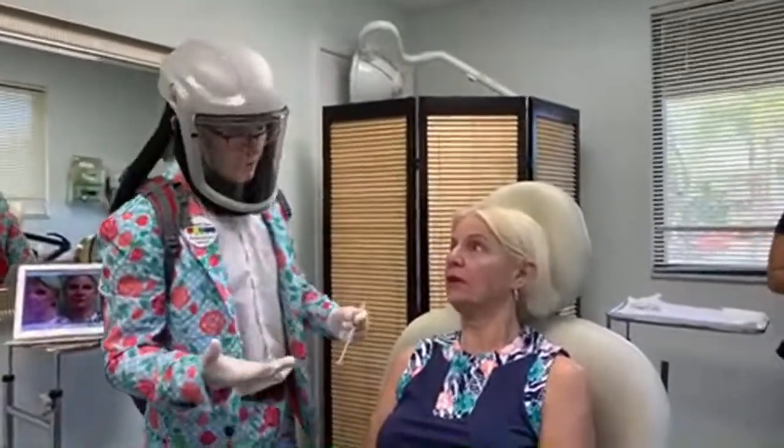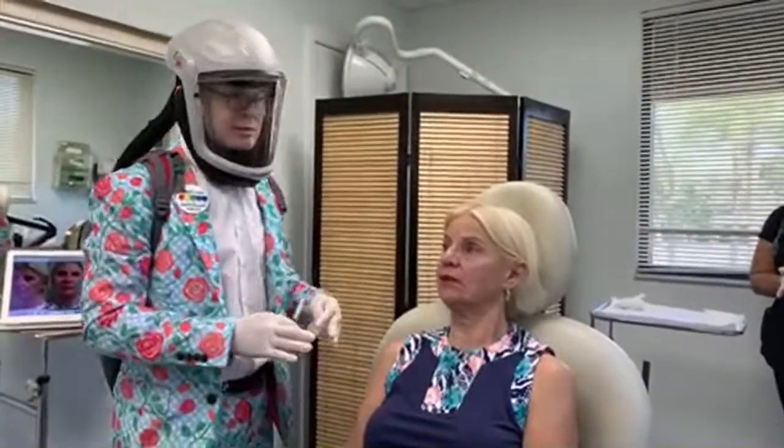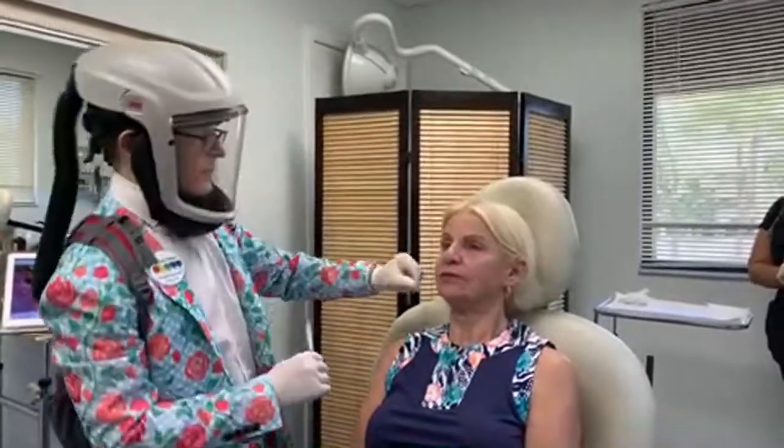This is also a pain test before I do anything else. How are we doing so far? Fine, I'm fine. I think I could tolerate the laser. Well, you had mentioned too, when you had laser before, they didn't numb you and you could feel it. No, they took a topical numbing. It didn't help very much, did it? No. Right, when I do laser, you numb the skin so you don't feel it. So topical numbing for laser doesn't work. I'm sorry that happened. It wasn't here, but that's why we do things differently.